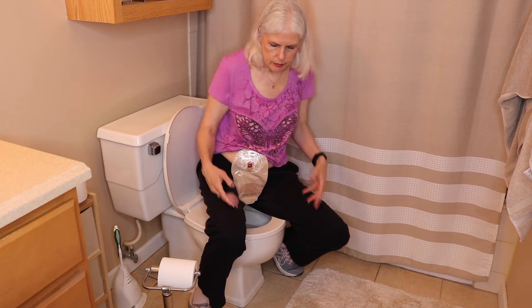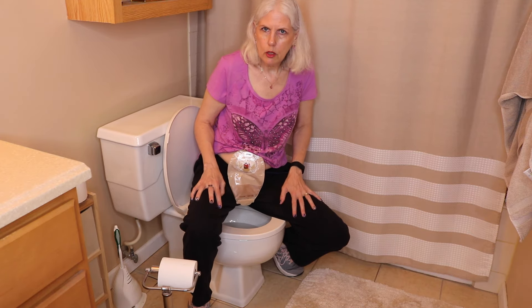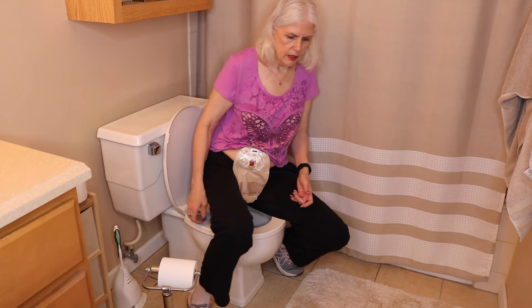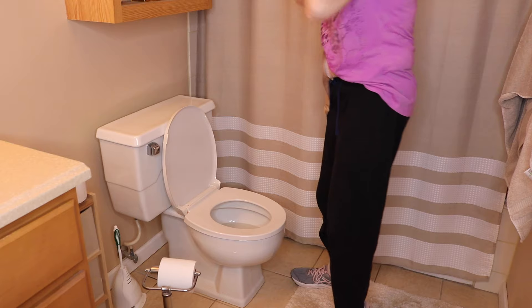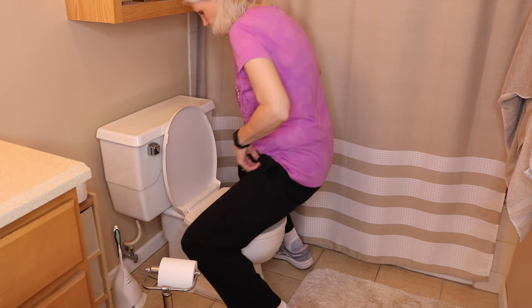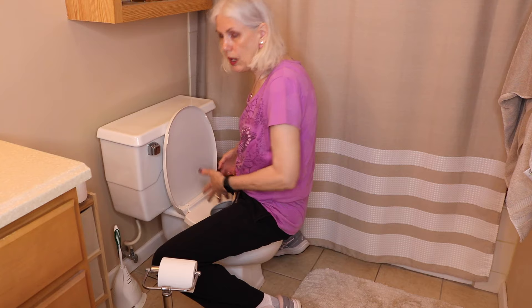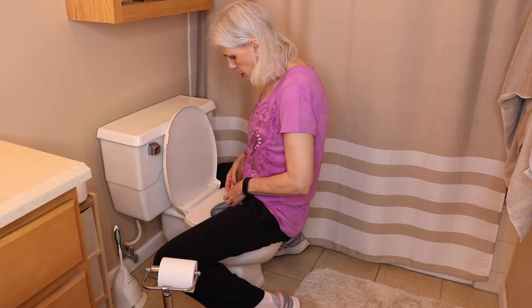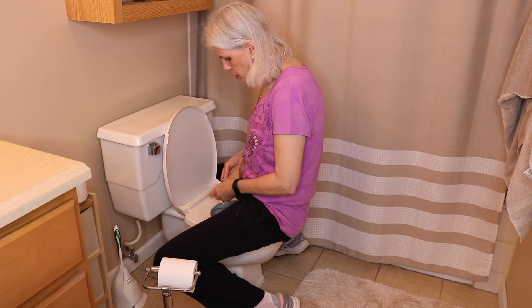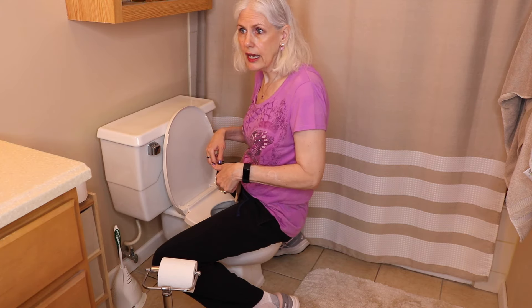So that's one way — sitting this way. Obviously when you go to the bathroom you sit down and can empty your bag. Another option is to sit forward on the toilet. Depending on how round or elongated the toilet opening is, you sit this way, same process — undo your bag and empty your bag.